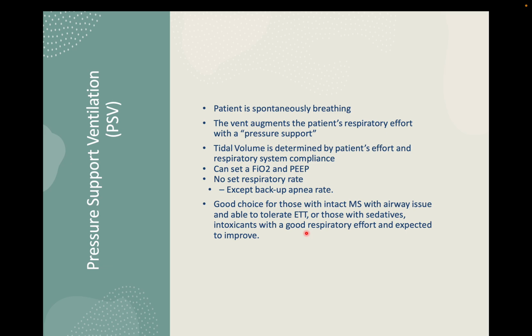In synchronized intermittent mandatory ventilation, whatever set rate you put, those breaths will be generated by the mechanical ventilator. Whatever extra breaths the patient takes spontaneously won't be supported by the ventilator. Those extra breaths depend upon the patient's effort. So there is a risk of hypoventilation in this case. You can convert AC to SIMV when the patient's spontaneous breaths and respiratory effort are good, slowly, as the patient is recovering.